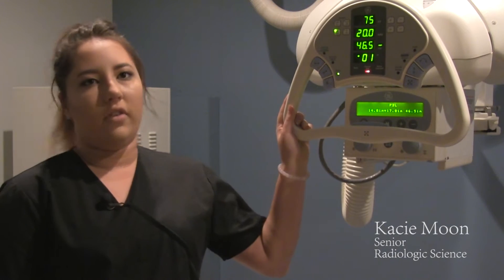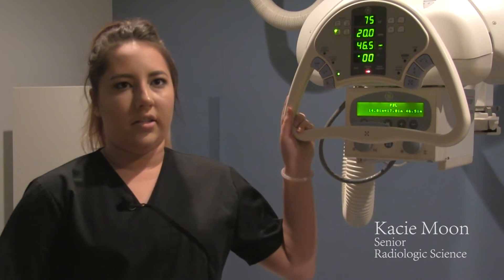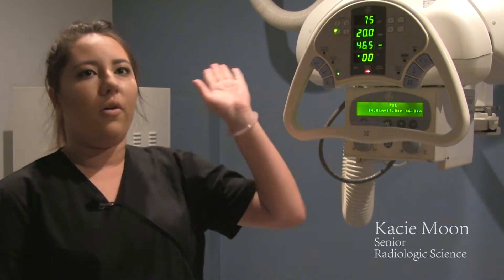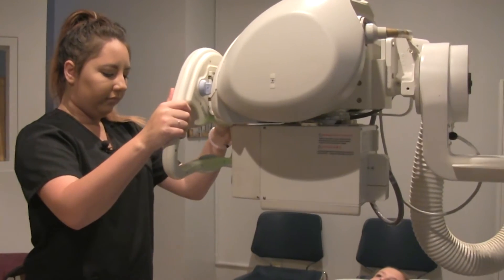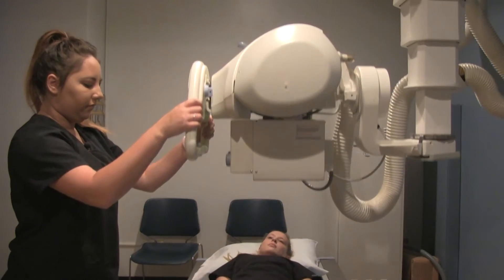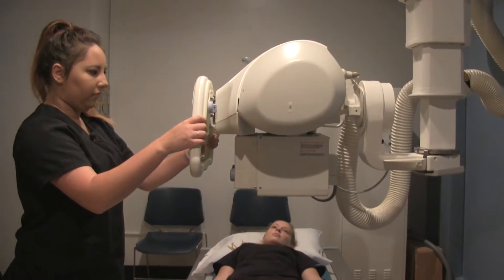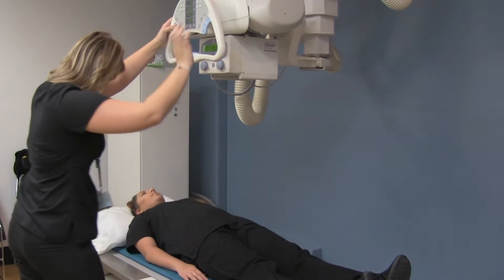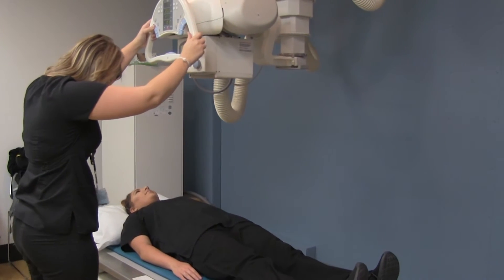Our tube we can move around to different areas of the room. It can go side to side and up and down. We normally position this over the patient of the area that we want to x-ray.